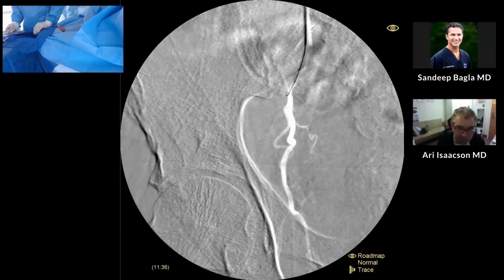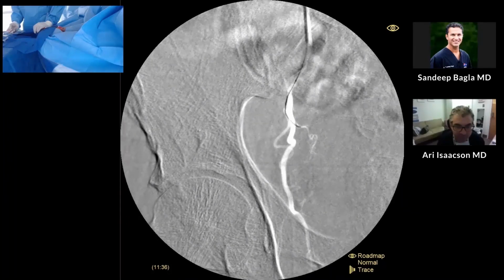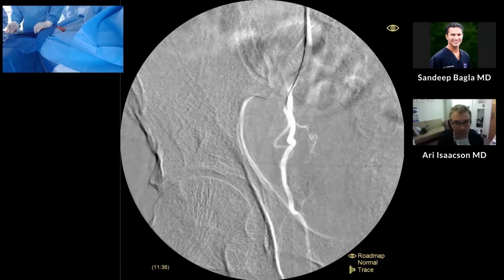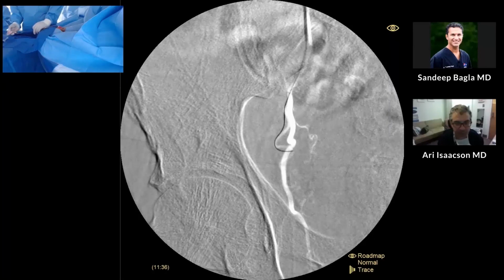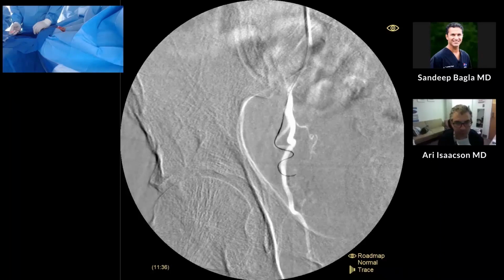Do you think that's a common trunk right there with those two? It's interesting you say that. It probably is. There it is. I think you're right. I think it probably was a common trunk, which is why that wire was catching it. Yeah. And then the question is how distal, but you can watch this catheter just go. Yeah. It'll just go. Unbelievable. So made all the way down that far.